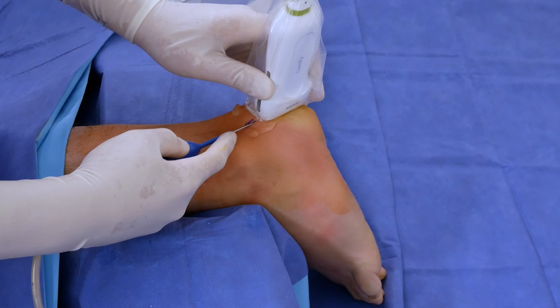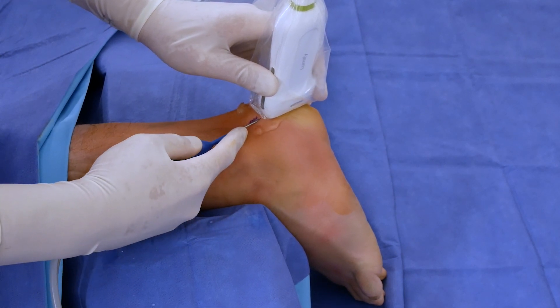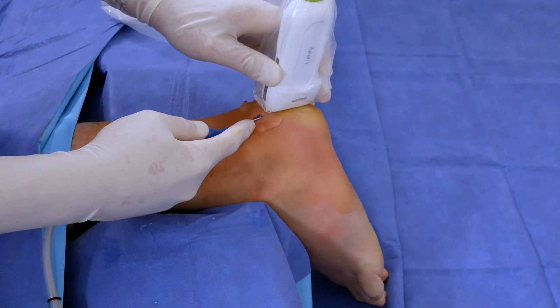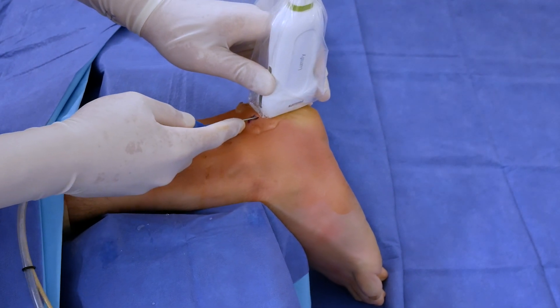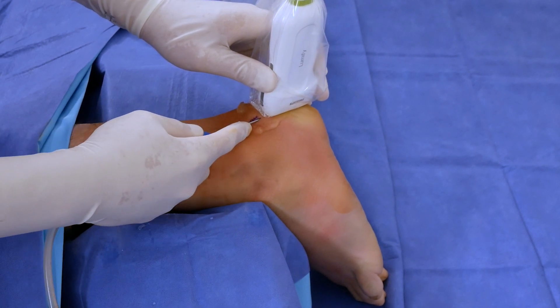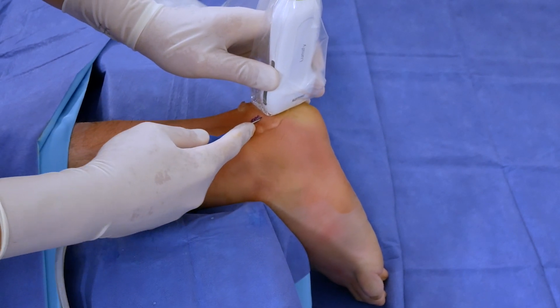An advantage of TenJet's three-inch working needle is that if necessary I am able to reach the medial aspect of the Achilles through one incision without the need to make additional incisions or going midline through the Achilles. This lessens the post-operative pain for the patient.